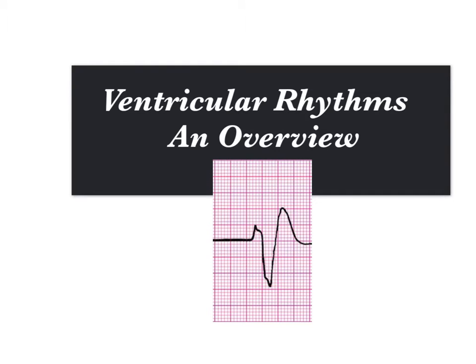Everyone, I just wanted to send this video out if you want to look at it. It's in reference to some ventricular rhythms we haven't really been across and done very much. But you do have a test coming up on Thursday, and we've hit on them, but I wanted to give you a little more of an overview and some things you may want to look up in your book.